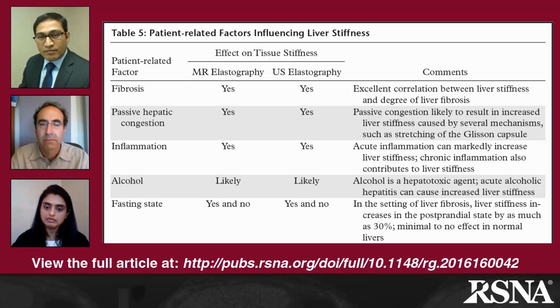Regarding the fasting status, now it's very interesting. The liver has dual blood supply from the artery and portal vein, and the portal vein is fed by the mesenteric circulation. When a person eats, the postprandial situation, typically between 30 minutes to 2 hours, especially after a high carbohydrate meal, increases the flow into the mesentery and into the portal vein. The normal liver is a very soft, compliant organ, like a sponge, so when this increased flow comes in, it accommodates it without any increase in stiffness. So in a normal volunteer, the stiffness does not increase.